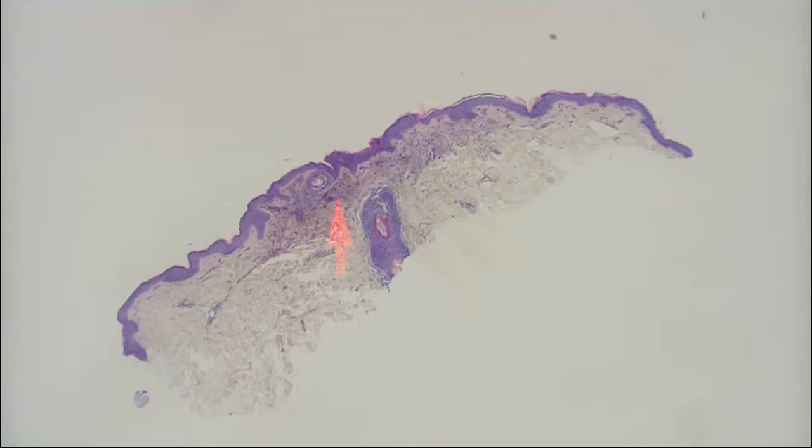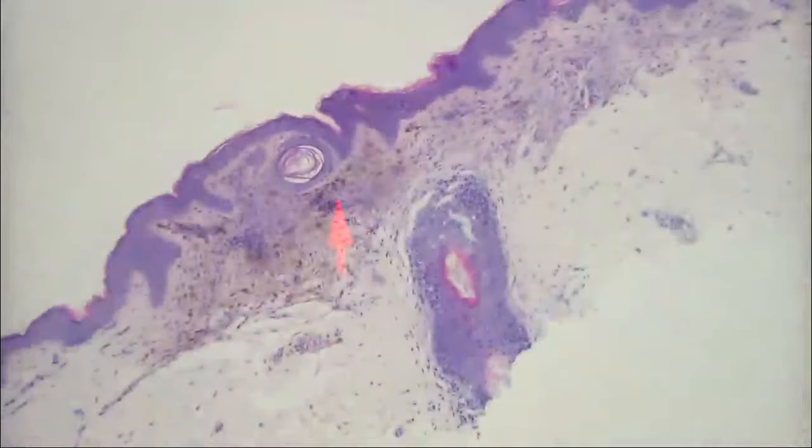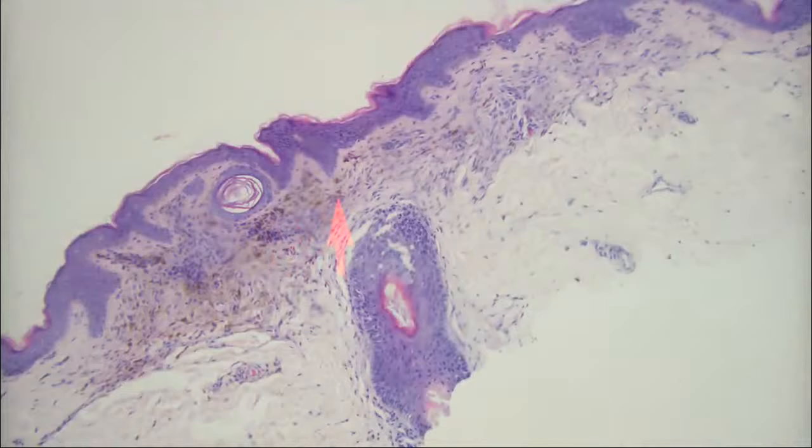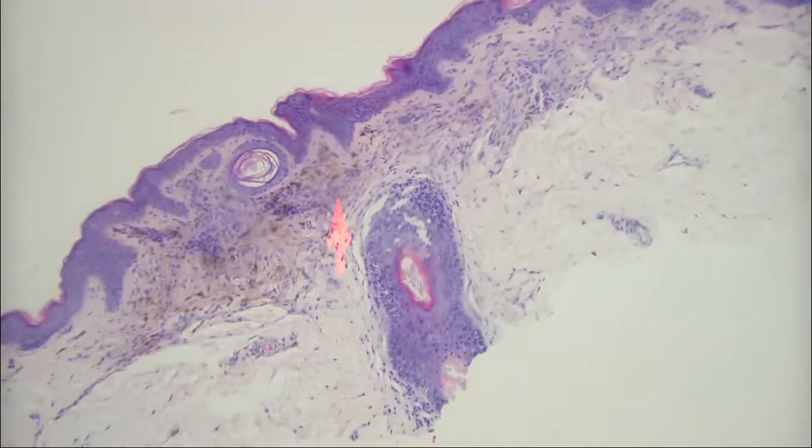That can be pseudo-benign because it breaks the rule. So I don't want you to think everything that's small, symmetrical, well circumscribed is benign. There's a metastatic blue nevus-like melanoma that can look small, well circumscribed. We use these things as guidelines, but they're not like the Ten Commandments. Okay, but back to this one. This one does obey the rules. So this is benign. Just a dermal nevus.